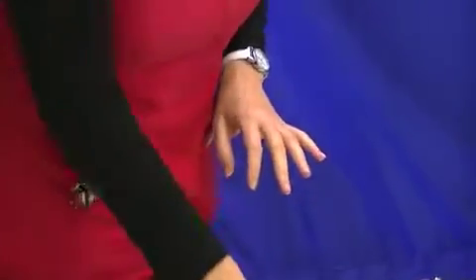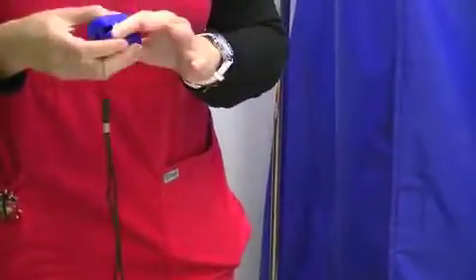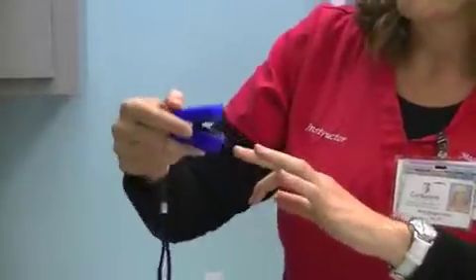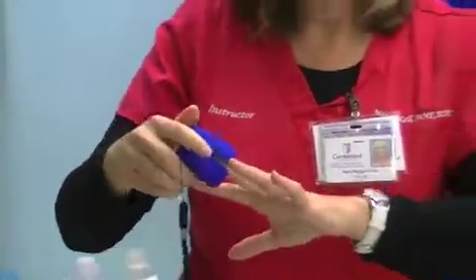And it interferes with the signal. Okay, so now I'm going to put on the pulse oximeter. I'm going to make sure this has a couple diodes in here. The diodes need to be lined up. Now that it's dry, I'm going to put this on the patient's finger.